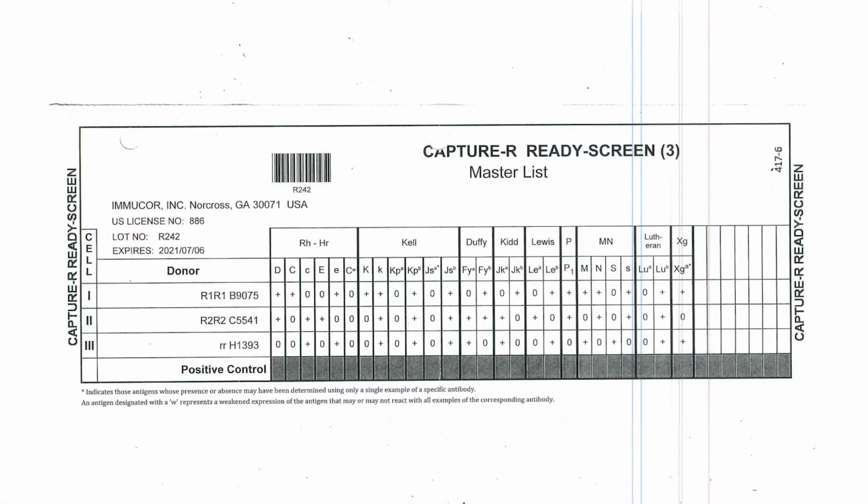The antibody screen results for our patient is 330. I bet you already know what to do. We are going to follow the same exact steps as we previously discussed in the single antibody identification.